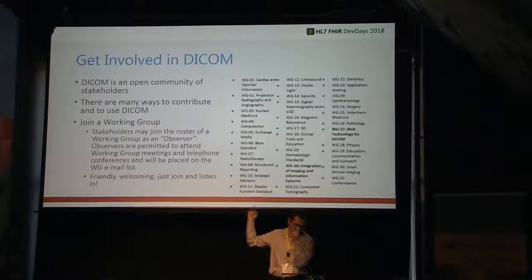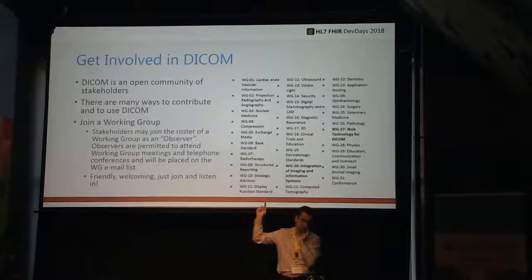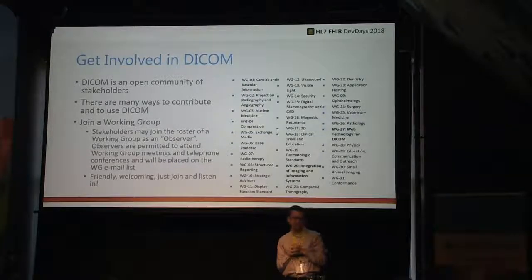There's a long list of working groups, but of course he points out two. So again, Working Group 20, the intersection between FHIR and DICOM. Working Group 27, web technology for DICOM. So they are the ones behind things like DICOMweb.